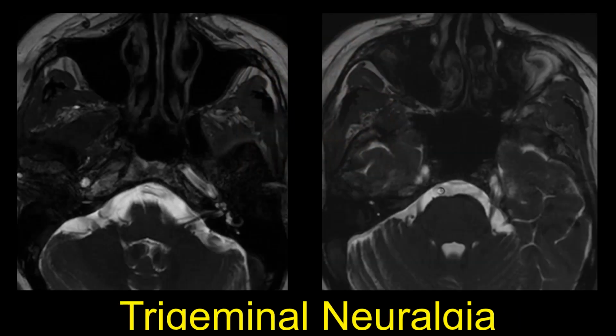Now, we want to be careful that that clinical information doesn't lead us astray. This was a patient that reportedly was having facial pain. And when we asked them, the type of pain was actually in the external auditory canal. But this was thought of as trigeminal neuralgia or geniculate neuralgia, where the surgeon thought that there was a small branching nerve traveling along with cranial nerve 7 that might be contributing to this patient's external auditory canal pain.